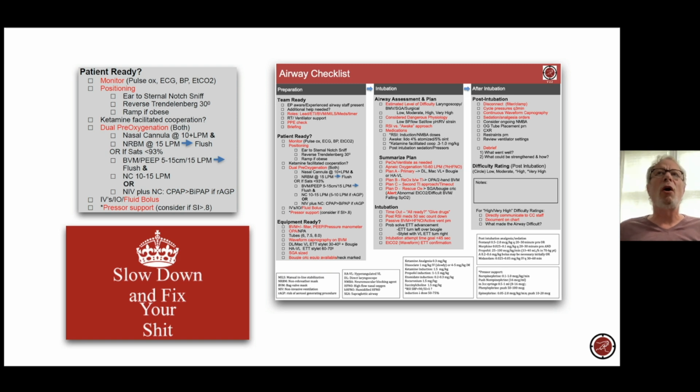And then we're going to use always two sources of oxygen. We're going to reinforce this in the workshop. If they've got normal lungs, then you can use an open type system. All patients are going to have nasal prongs on, right? Nasal prongs under. When somebody is not sedated, they don't tolerate more than 10 liters very well. It can be irritating and cause some agitation. So that's why while they're awake, I will limit it to 10 liters. You can crank it up to 15 liters once you put them to sleep, if you remember that. But after 10 liters, they can get a little bit agitated.